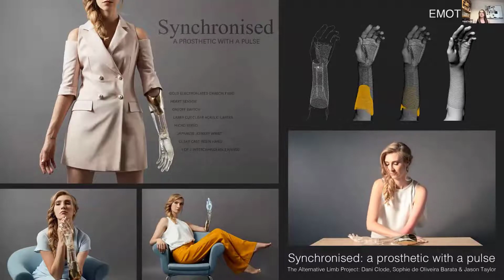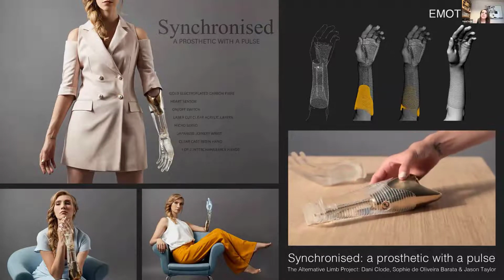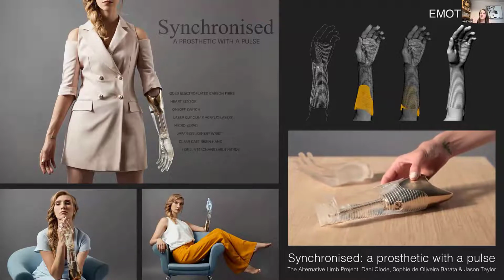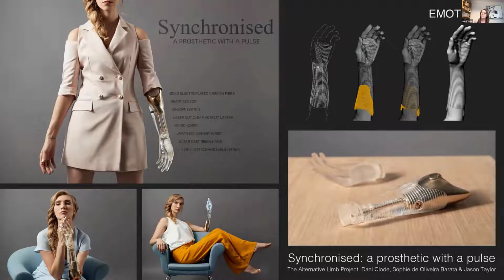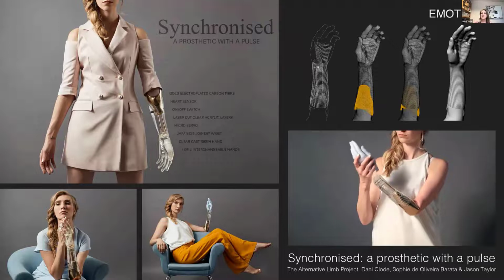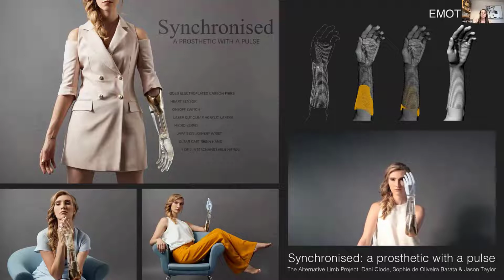So our first piece together was synchronized, and this was to explore an emotional connection between the wearer and the object. And with this arm, we decided to completely flip the usual order of focus of a prosthetic and show Kelly's actual arm shape, which you can see in the electroplated carbon fiber socket. So the socket that usually completely hides the arm is now celebrating her body shape. So this then slowly transitions into clear layered acrylic pieces that form a one-to-one mirrored recreation of Kelly's right arm, showing this kind of visual connection with the body. Also, when she turns it on, there's a layer in the wrist that ticks in time to her heartbeat and can continue to tick when Kelly's not wearing it, which creates this kind of lasting connection when there's no longer a physical one.